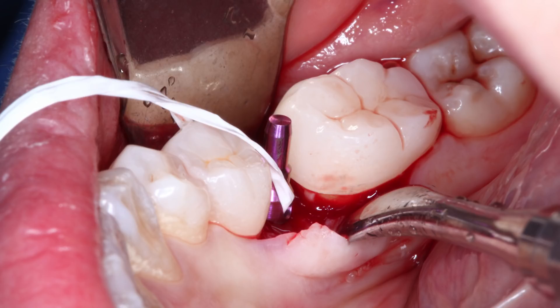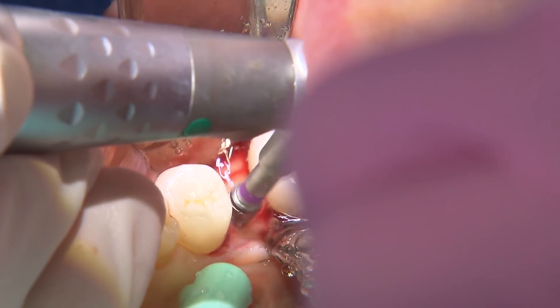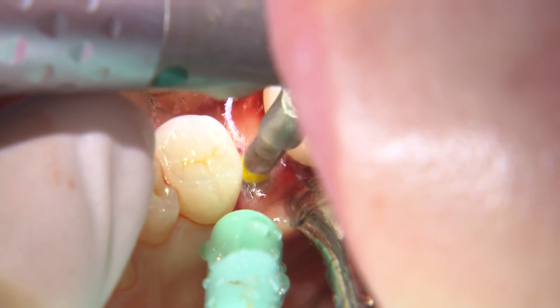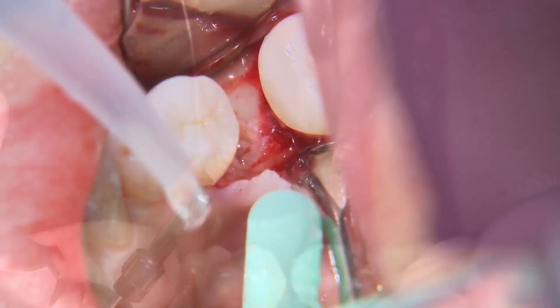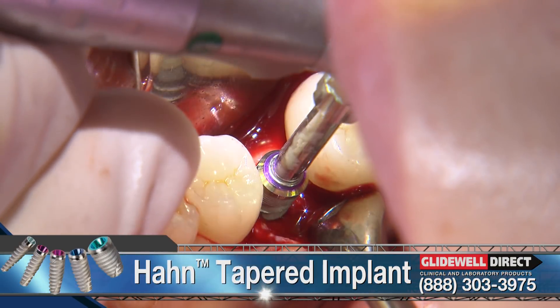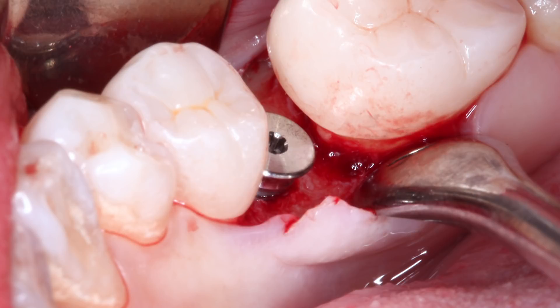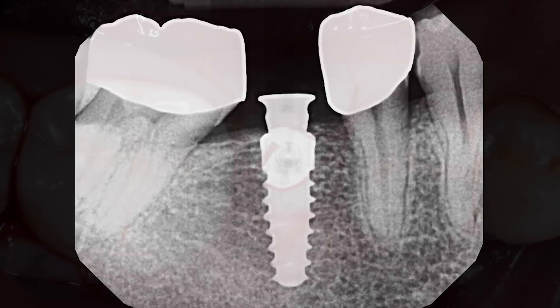With the parallel pin in place, I take a radiograph to verify that I'm in the correct position. Minor corrections to the angulation can be made using the subsequent shaping drills or a side-cutting bur such as the Lindemann drill. Since no modifications need to be done, I move on to the 4.3 by 11.5 millimeter shaping drill in the Hahn surgical kit. Once the shaping drill has been placed to the proper depth, it's time to place the implant within the osteotomy. I dial the handpiece speed down from 800 to 25 RPM to carefully position the implant slowly. Once fully seated and primary stability is achieved, I place a 3 millimeter healing abutment that allows the soft tissue to heal around it. I then place a couple of interrupted chromic gut sutures to achieve primary closure of the flap.